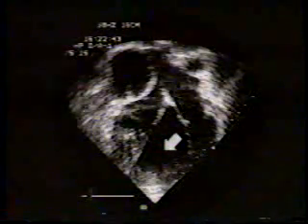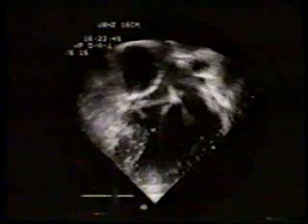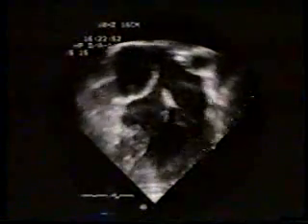This is the apical examination of an 18-year-old patient with double inlet left ventricle who underwent Fontan repair. This is right atrium. Note here the distinctive appearance of the patch in low right atrium excluding the right atrioventricular valve from the systemic venous return. Atrial septum was intact and the right and left AV valves can be seen here. Main ventricular chamber is dilated with normal systolic function. Observe these characteristic features in real time. Note the patch in the atrium is intact and no evidence of dehiscence is present.